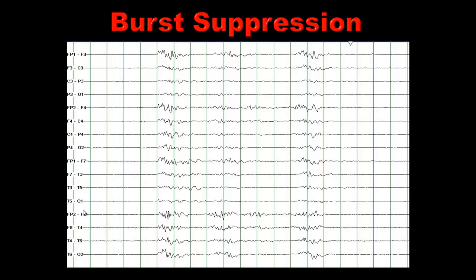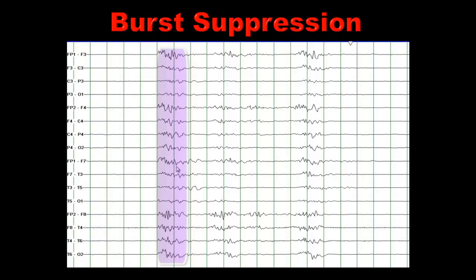Burst suppression pattern — why is it called burst suppression? Because of the picture you see on the slide. This is a period of suppression where amplitudes of the EEG are even less than 5 µV, then there is a period of a burst of activity — in this case it lasts 2 seconds — then some suppression, then another burst. When reporting a burst suppression pattern, you have to identify that the bursts last anywhere from 2 to 10 seconds and the periods of suppression last from 5 to 10 seconds.